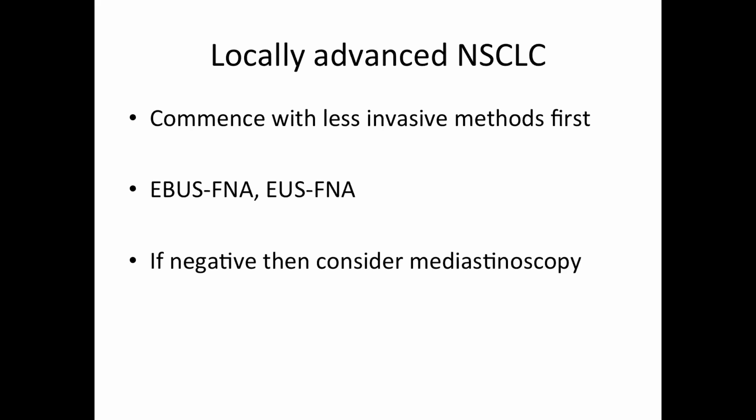So they will very often be able to give us answers, and that's one reason that we're doing fewer mediastinoscopies. We've already got a PET scan, we've got suspicions that we think this might be locally advanced, and we need to confirm what the answer is before reaching a conclusion on how to move forward. But the result has come back and the EBUS is negative.